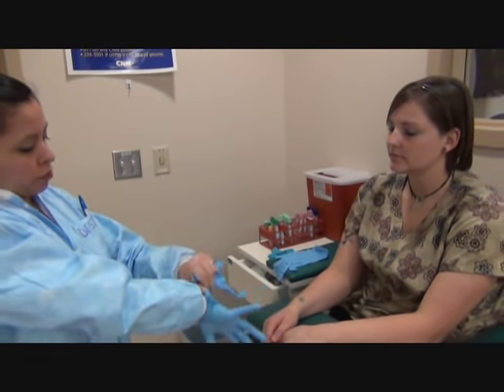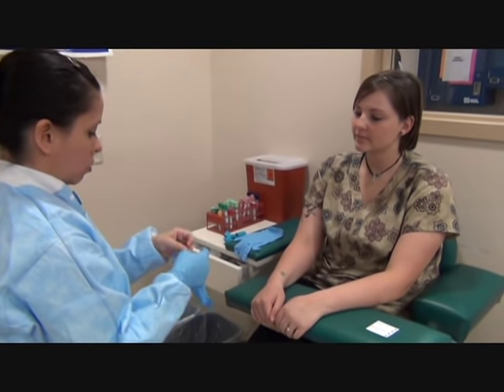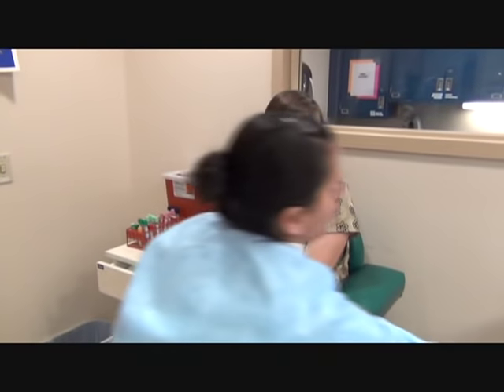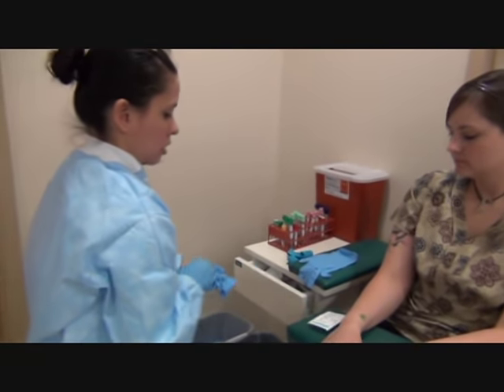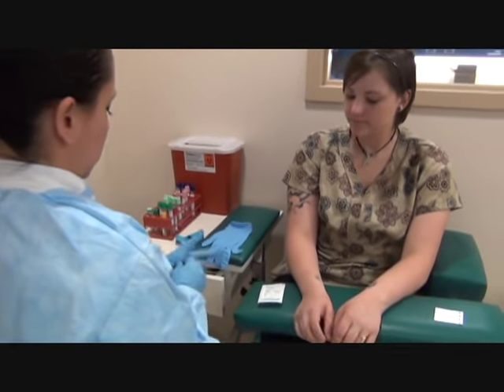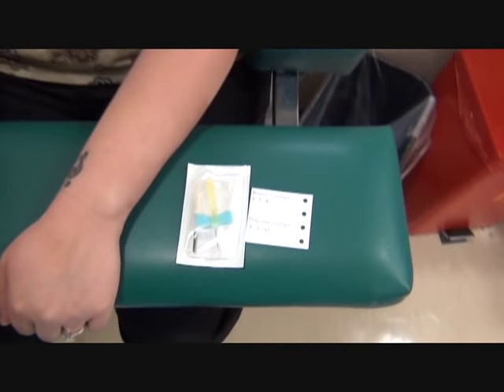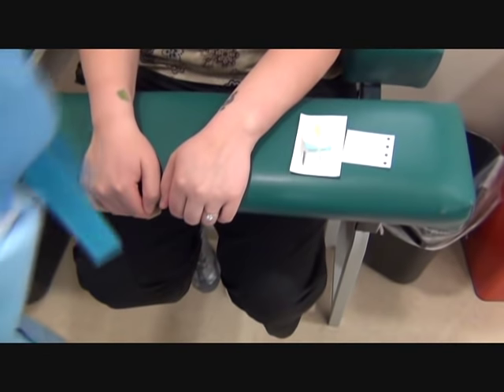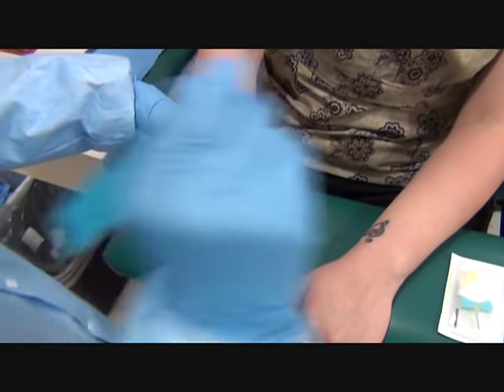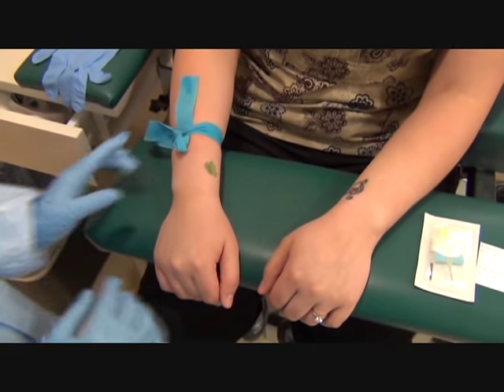Which hand do you prefer? I'm going to be doing a butterfly hand draw. I'm going to be using a BD vacutainer butterfly that you activate outside of the hand or the patient's arm. I'm going to take a look. I'm still going to tie the tourniquet four inches above the site, regardless of the location. So because I'm going in her hand, I'm going to tie it four inches above her hand.